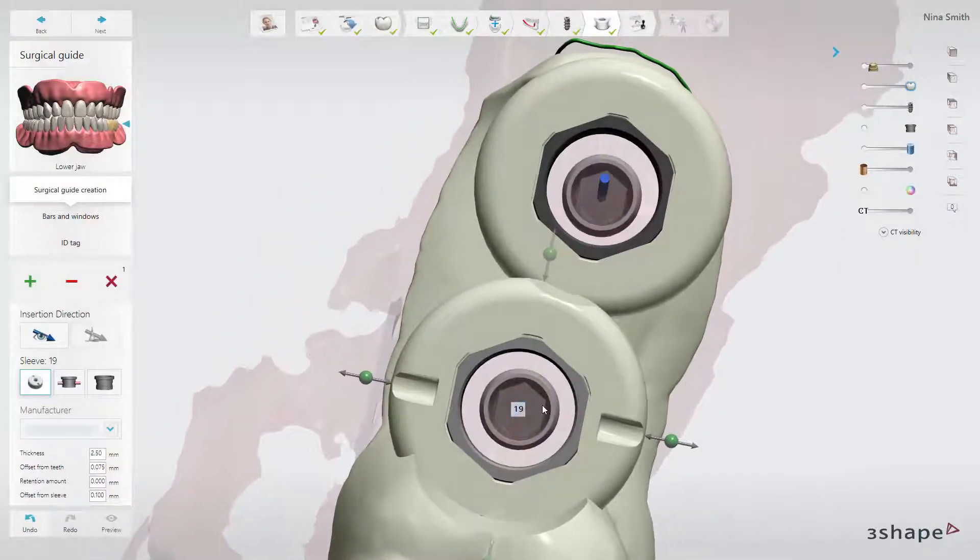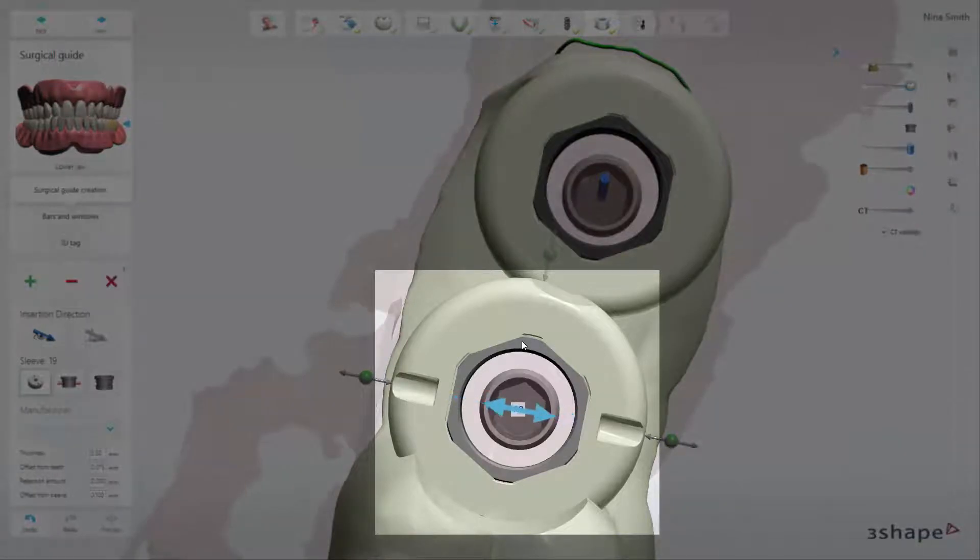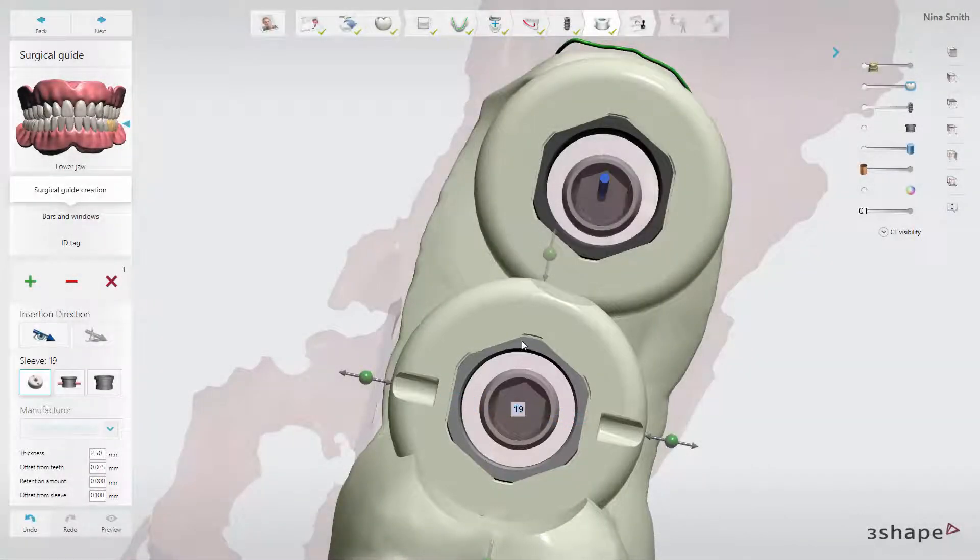When using a guide, you can also place sleeve orientation marks directly on the surgical guide to control the implant rotation. This will help you achieve the planned implant connection position during the surgery.